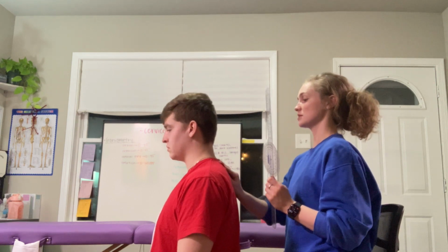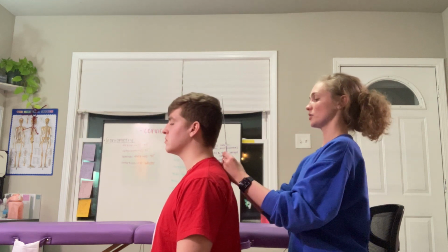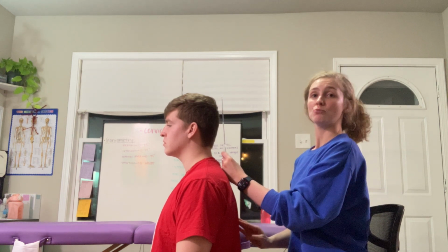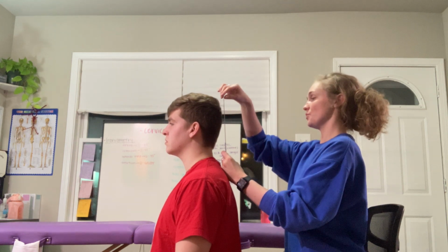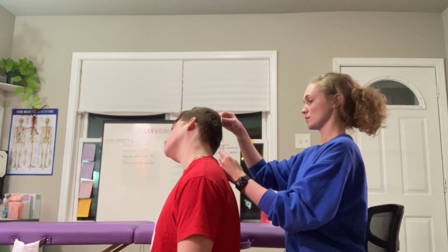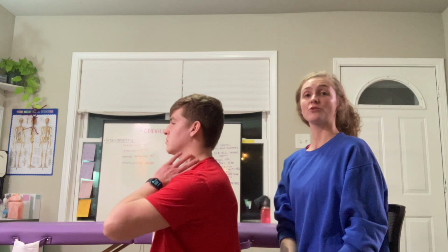We are going to find that C7 spinous process again. Come back up. Align our goniometry fulcrum with that. Stationary arm perpendicular to the floor and moving arm in the midline of the skull. Alrighty, whenever you're ready, we're going to go to the right-hand side. Alrighty, our patient has 36 degrees of lateral flexion on the right-hand side, which is once again below the normal range of motion value for lateral flexion.